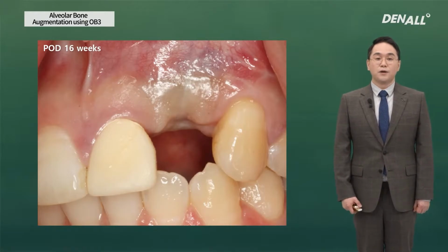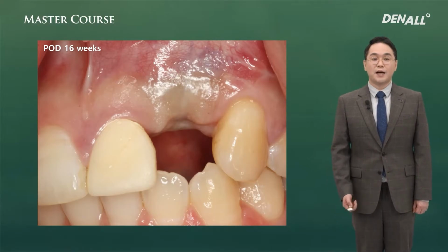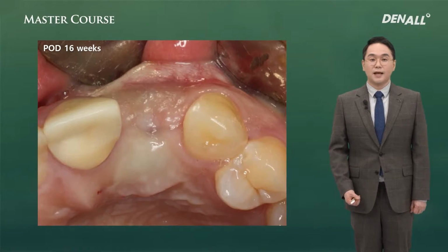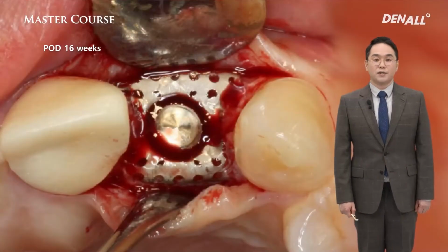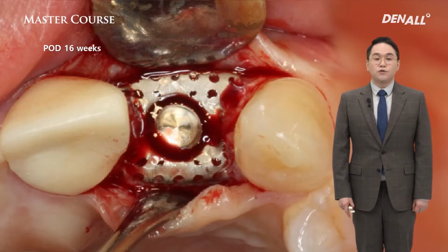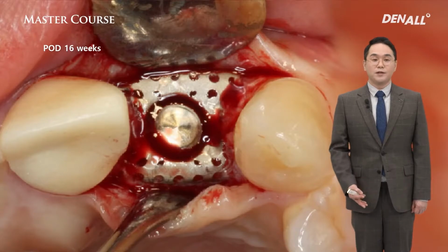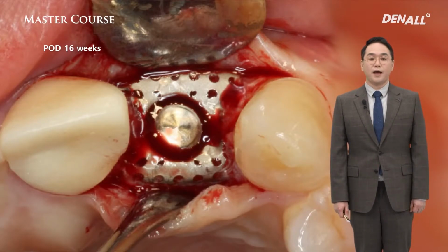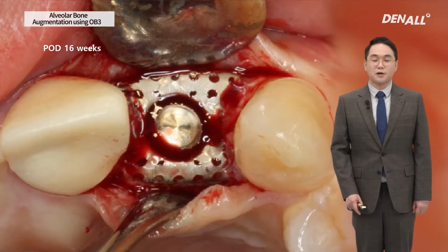Post-op 4 months, the Jawbuilder is removed and the implant will be placed. It is healed. On the occlusal view, we can see the augmented alveolar bone volume. The flap is raised and the vertical incision line is not made because the Jawbuilder is fixed over the tenting screw with a cover cap, so a vertical incision is not necessary.